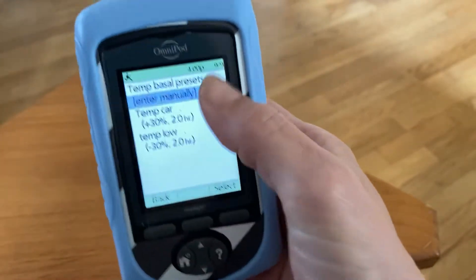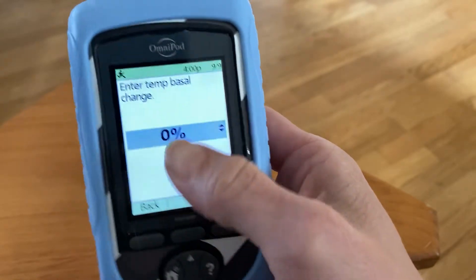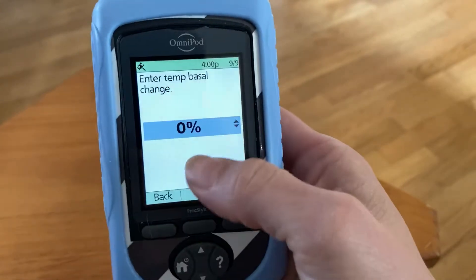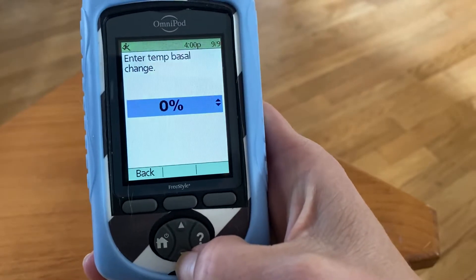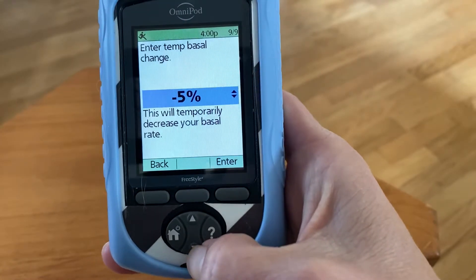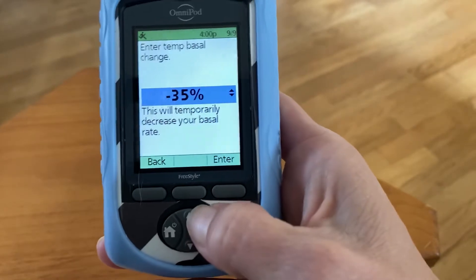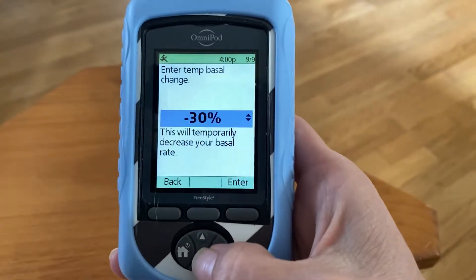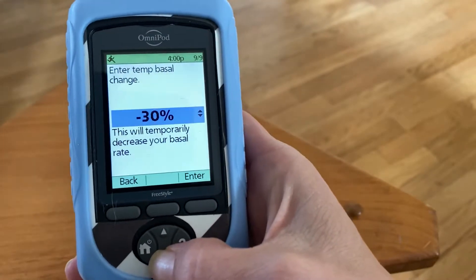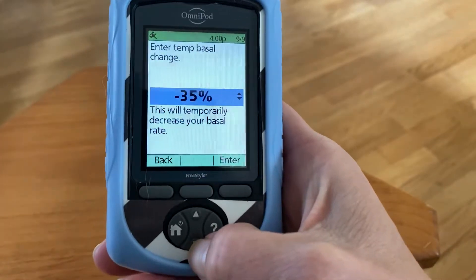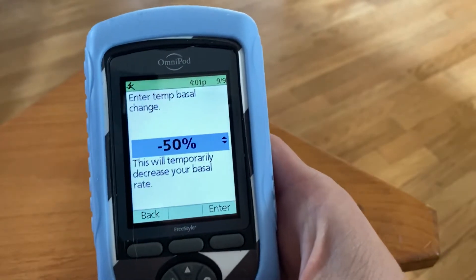If you want to do a manual one, you just select manual. Here is your screen where you can do a temp basal increase or decrease. If she was low and you wanted to do a decrease, you just scroll down — minus 5 percent, minus 20, minus 30. I would start with probably minus 30, depending on how low she's going, but you could do up to minus 50 percent.